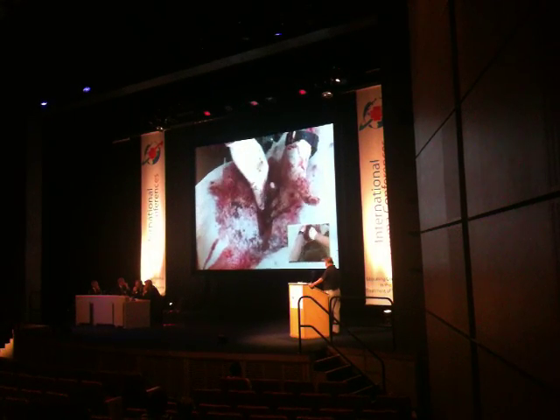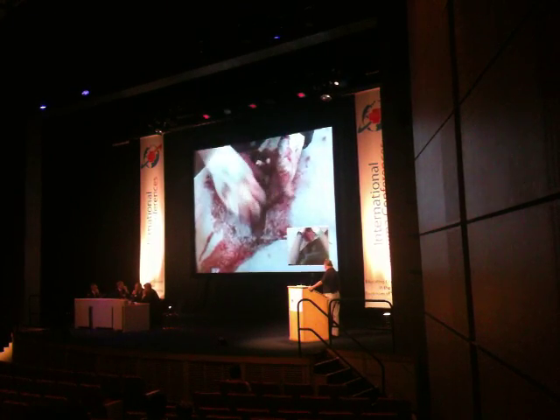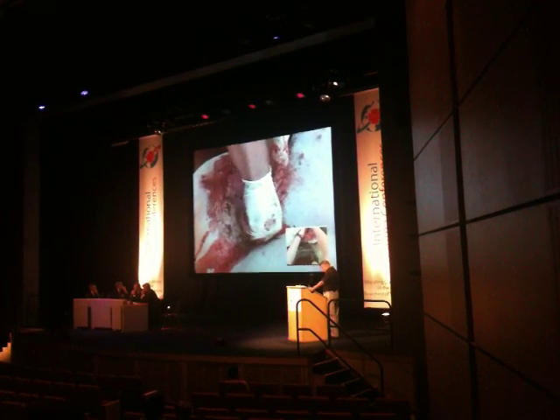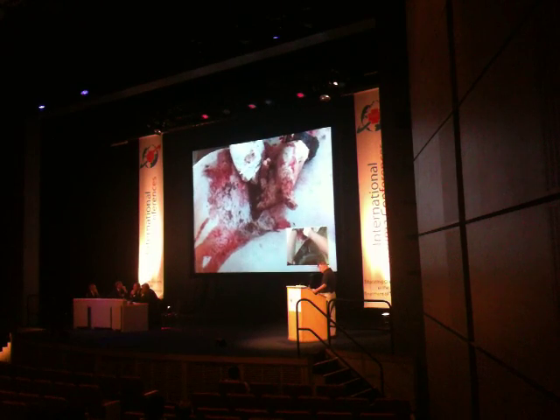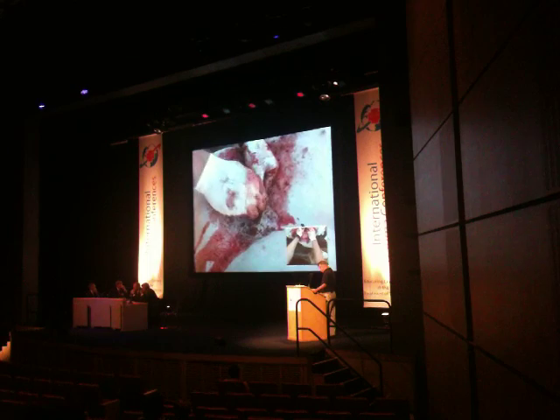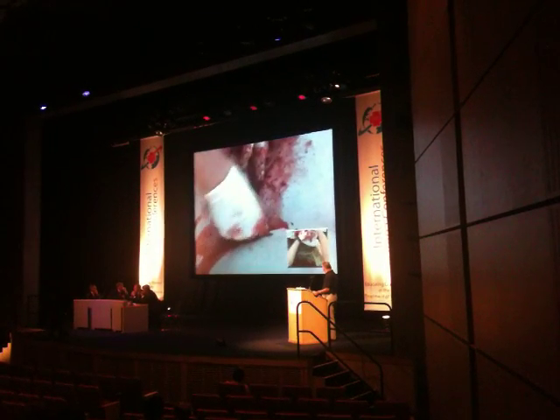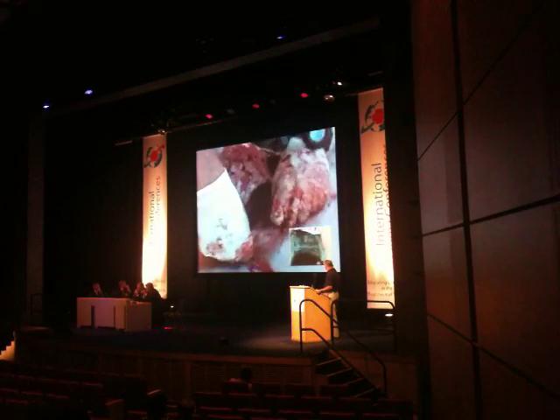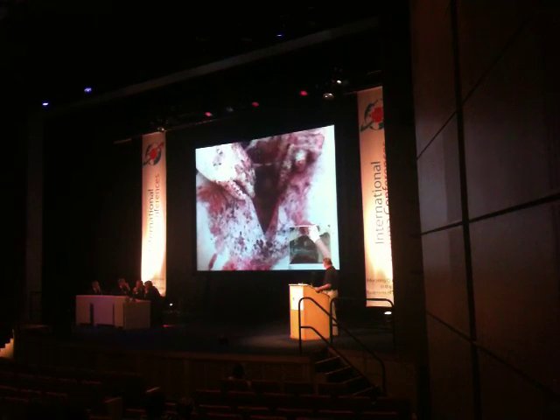You can see that we already have substantial control of this high-pressure bleed, even at this point in the process, and we're three minutes in. Still moving agent around, packing it on top of the other agent, and forcing it down into the bottom of the wound bowl. We are now three minutes and 20 seconds into the bleed, and we have hemostasis achieved.